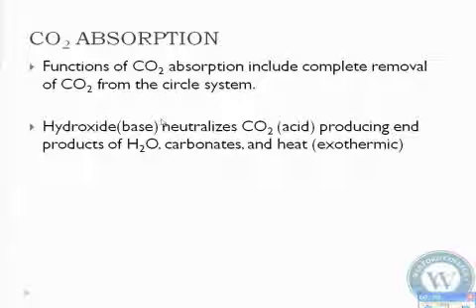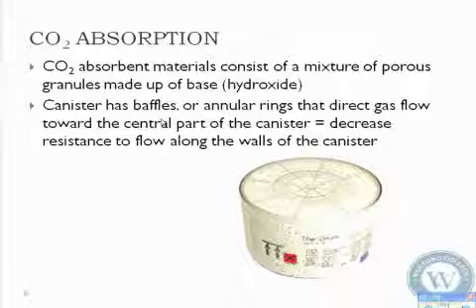But the Baralyme, that thing would literally burn your hand. It would cause entire CO2 canisters to melt at times. That's why they pulled it off. Okay, because patients got hurt. Okay?